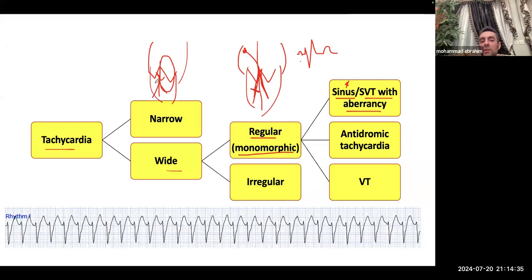This is why some patients with SVT get aberrant conduction down the left or right bundle. So the SVT for that patient would be wide QRS because it is in fact SVT with aberrant conduction. Not every SVT is narrow complex, because sometimes the right or left bundle gets blocked during SVT. Understood? It's a little bit too advanced for a pediatrician or neonatologist, but I'm trying to simplify it. Okay?